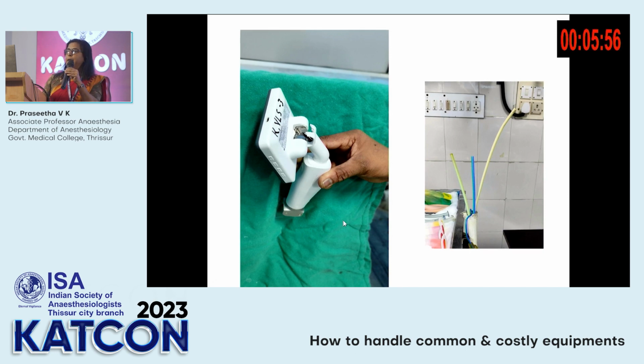Somebody has tried to remove the blade and they have damaged it at this point. Now it is beyond repair.